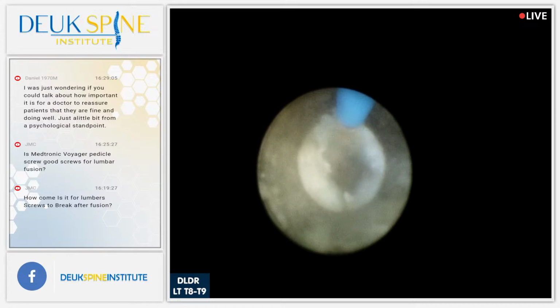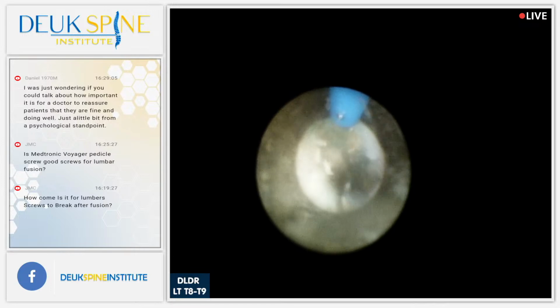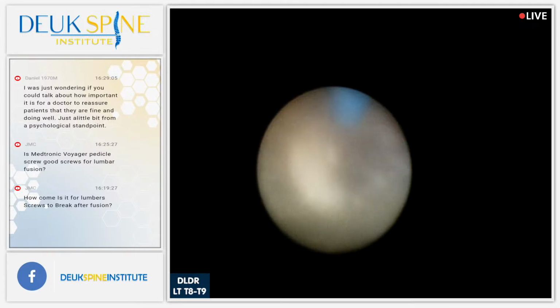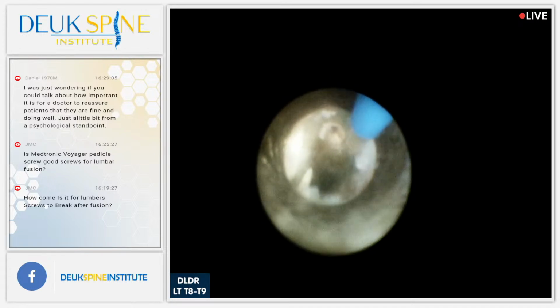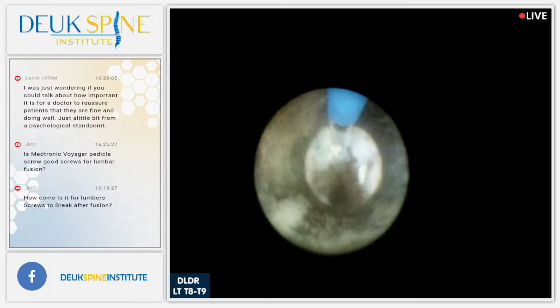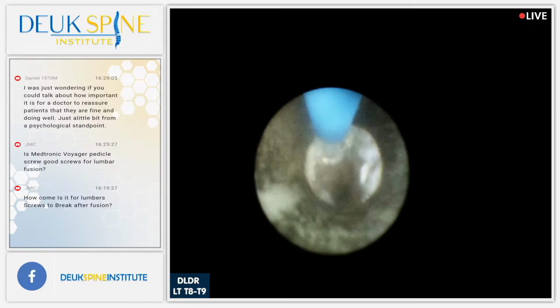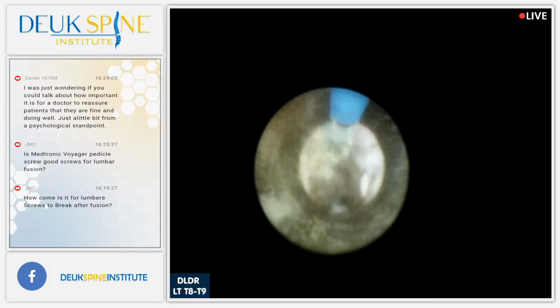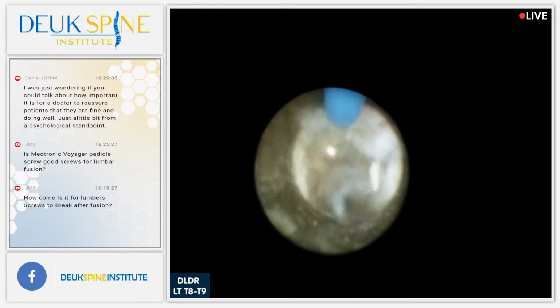Well, it's interesting here, because I thought I would be done quicker, but just about. Literally 30 seconds. I think we'll be done. This has got to be it right here. I must have been in the disc deeper than I thought, just because he must have been twisted a little bit. There's a little bit of calcium here.